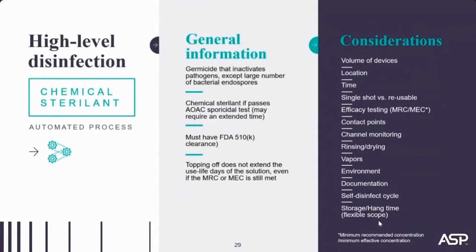The considerations are volume of scopes that need to be processed. Is there a location that can be dedicated to the task? Do you want a single-shot high-level disinfectant, or do you want a reusable one that expires with time or efficacy? Does the system allow for minimum contact points, ensuring the high-level disinfectant reaches all surfaces? Are test strips needed to check the efficacy of the high-level disinfectant prior to each use? Are there quality control checks to ensure the test strips are performing correctly?